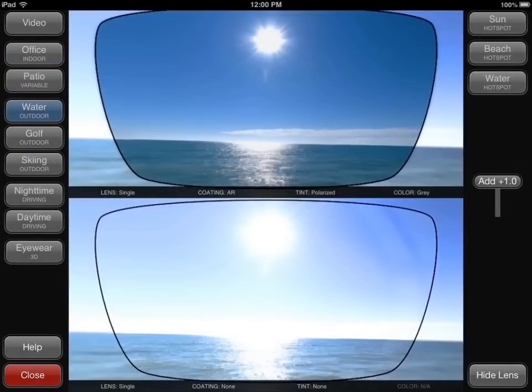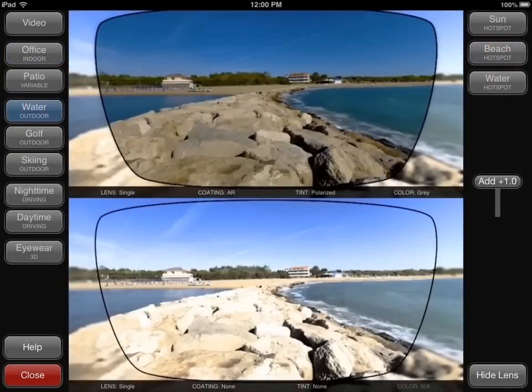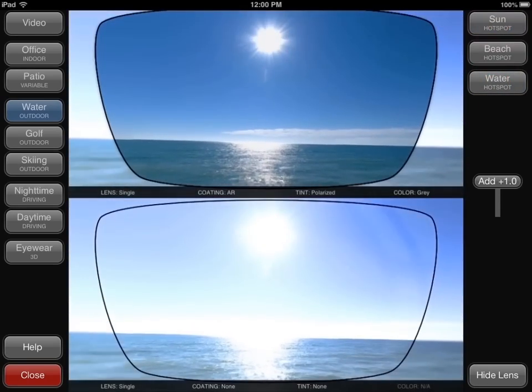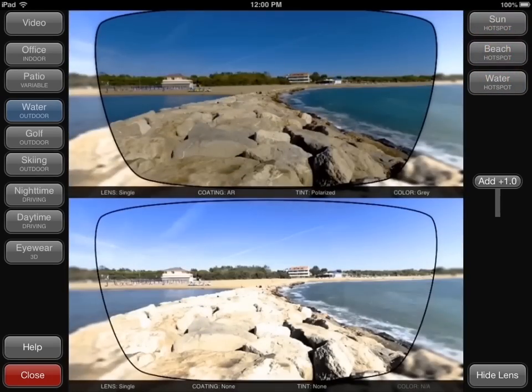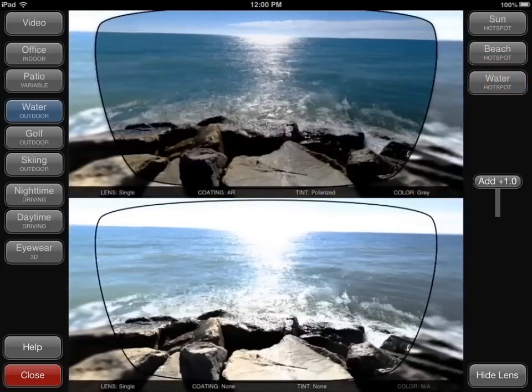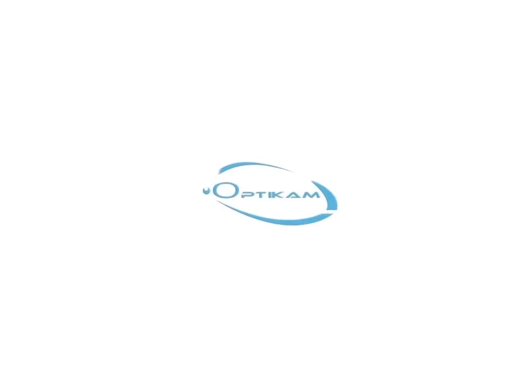In each scene, a list of hot spots are available on the right side of the screen that allow you to instantly pan the lens to a specific location. This allows you to quickly illustrate lens benefits in meaningful areas of the scene.